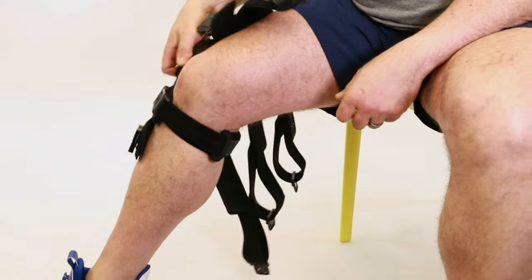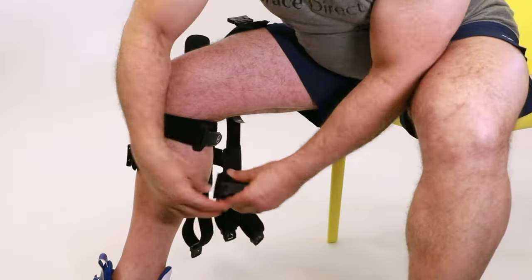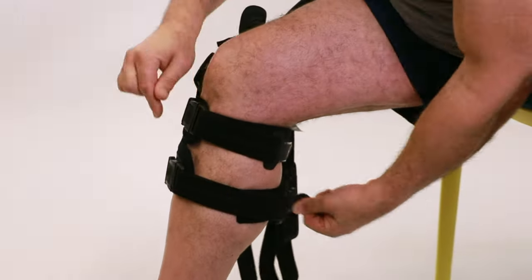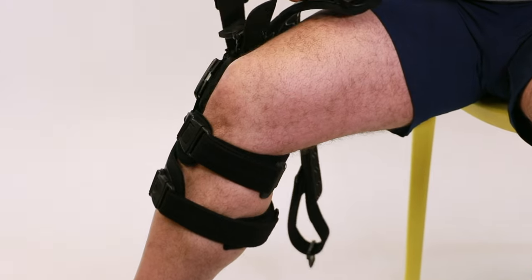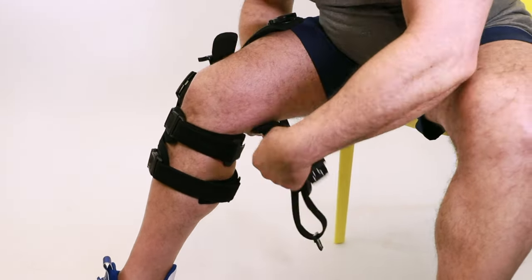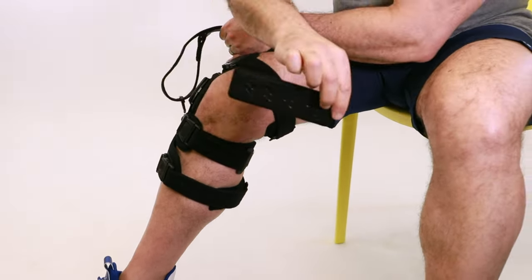Repeat this process with straps 2, 3, and 4: unfastening the velcro, removing the anti-migration pad, positioning them at the back of the leg, wrapping the strap around the leg, re-securing the pad to the strap, fastening the buckle and then tightening — making sure not to over-tighten.